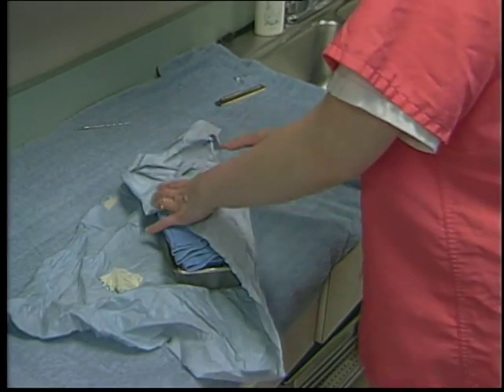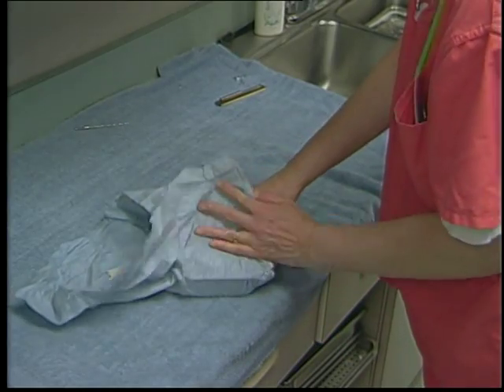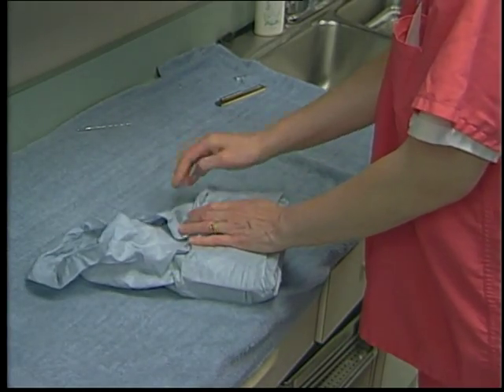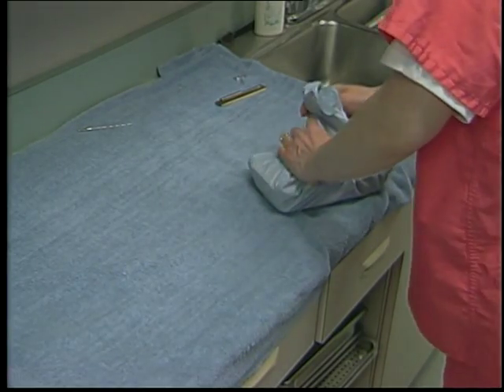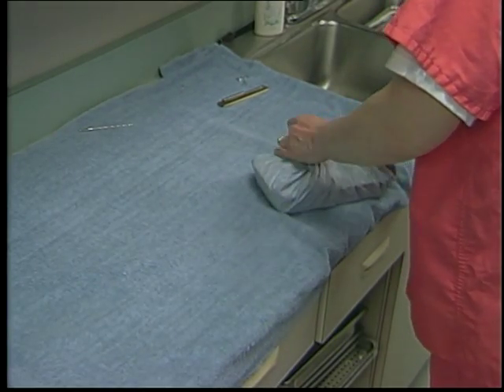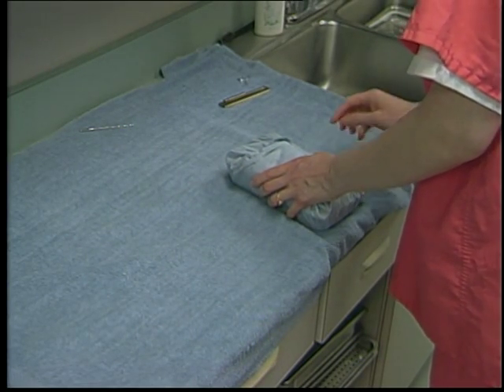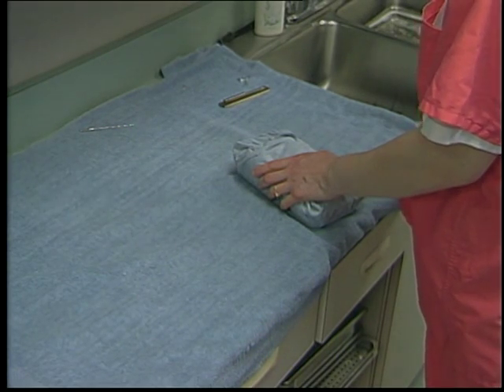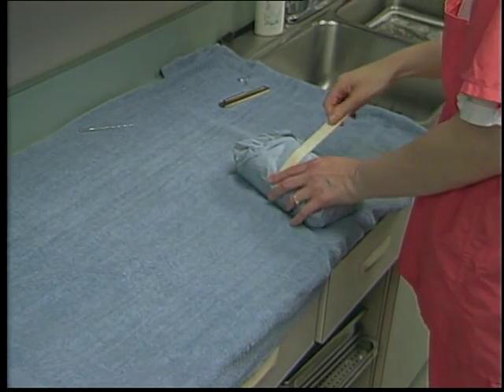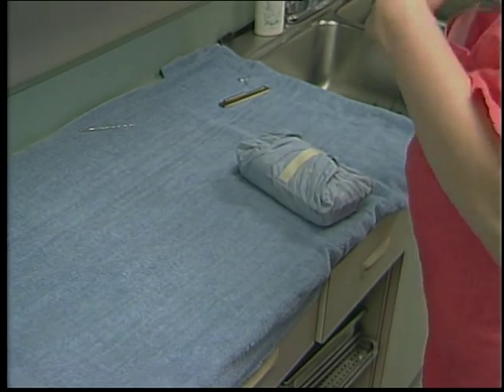Before repacking the surgery pack, make sure that all instruments are accounted for. This is often done by having a checklist or illustration showing all the instruments in that particular surgery pack. Every instrument is important and should be accounted for. Once the pack is wrapped, it is taped with sterile indicator tape. Masking tape may be substituted, but always have a short piece of indicator tape visibly present. The surgery pack is now ready to be sterilized in the autoclave.